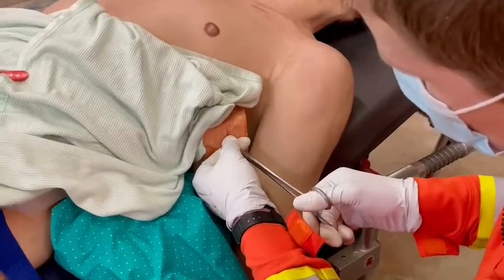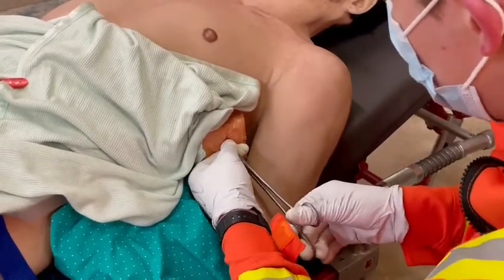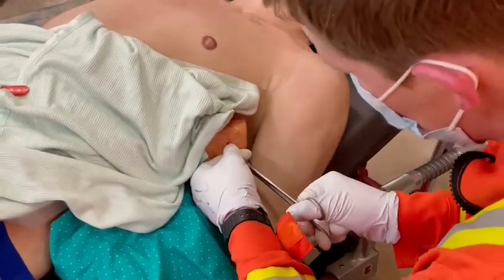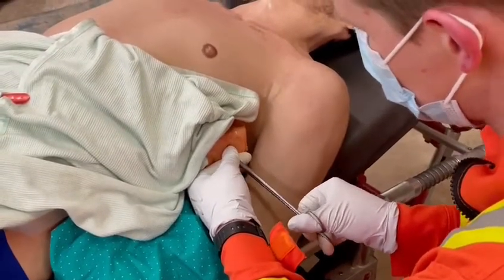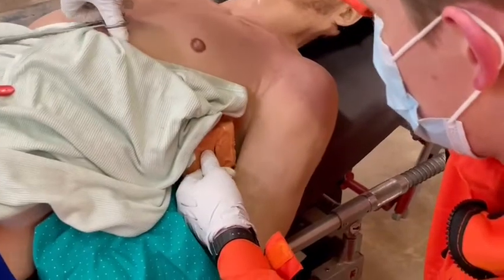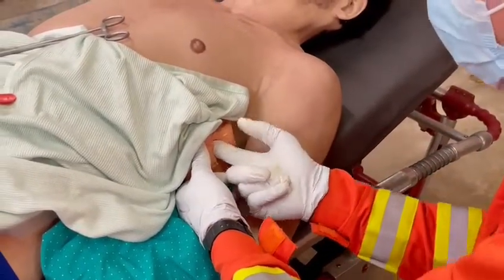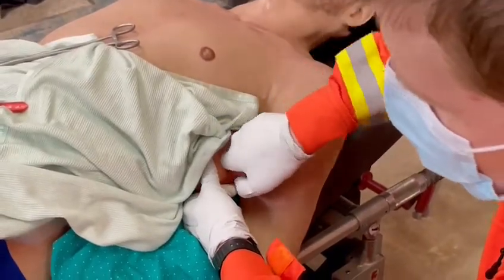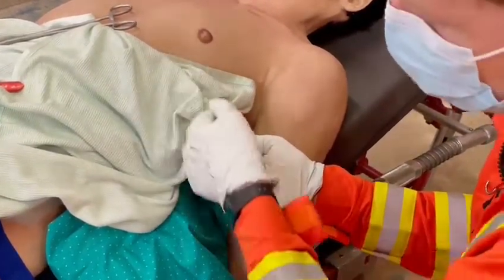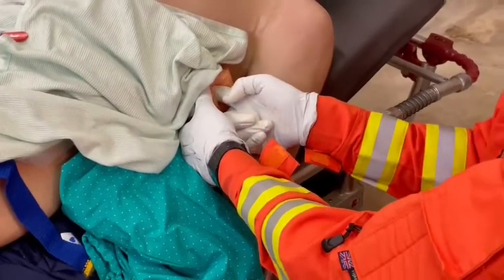I've got my left hand there giving me stability and preventing me from slipping too far deep into the chest. I'll use the closed front of the instrument to work up and down, stripping away muscle from the rib to increase the space, then open them slightly as I withdraw to keep the tract open. I'll then use my sterile finger to go into the thoracostomy and sweep around, confirming the tract is certainly into the chest wall and allowing me to assess whether the lung is up or down. Having already popped through, there may be a big air release — indicating tension pneumothorax — or possibly a gush of blood.